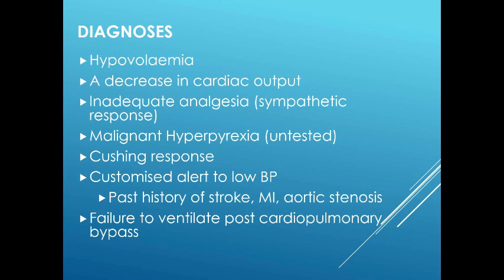A decrease in cardiac output associated with hypovolemia is diagnosed by detecting a significant fall in end-tidal CO2 in the presence of steady ventilation. The changes in CO2 are subtle and would require vigilance and a keen eye to detect the early changes.